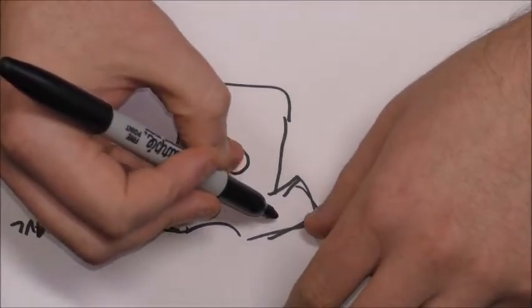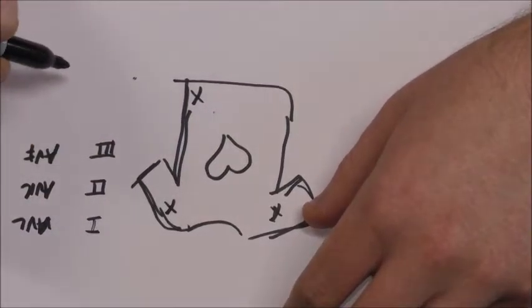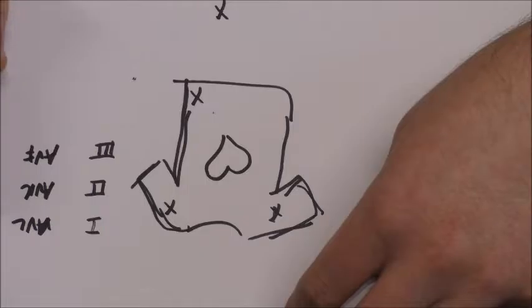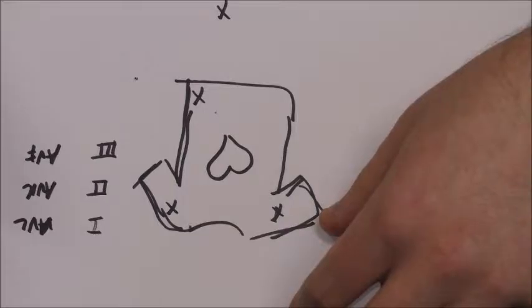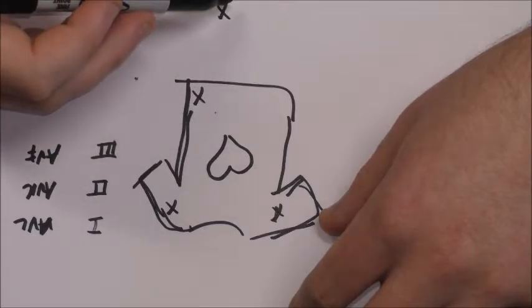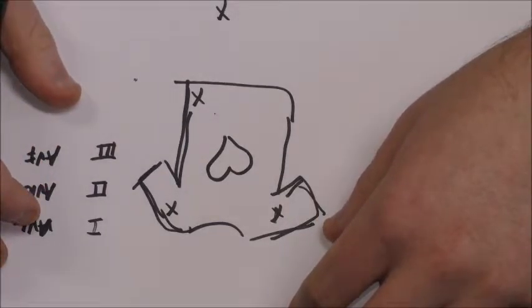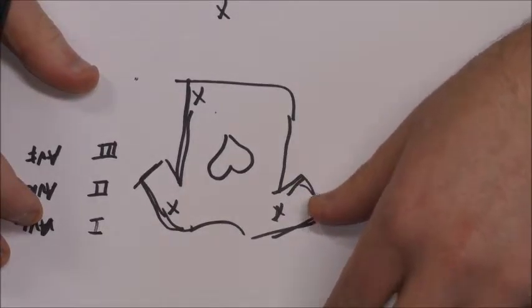So you'll have one lead here, one lead here, one lead down here, and then you'll have a foot lead. You normally put that on the patient's leg. So these 4 leads then actually make up these 6 data points. And again, the way that they gather that information from 4 leads has to do with Einthoven's triangle, which requires a much deeper review of both physics and physiology. So that's a simplified version of that.